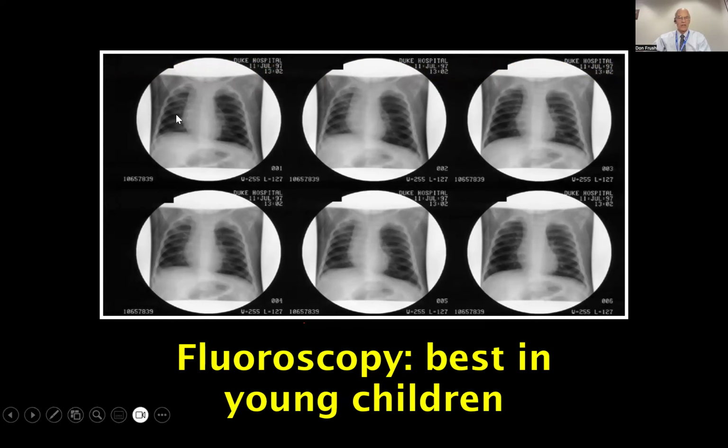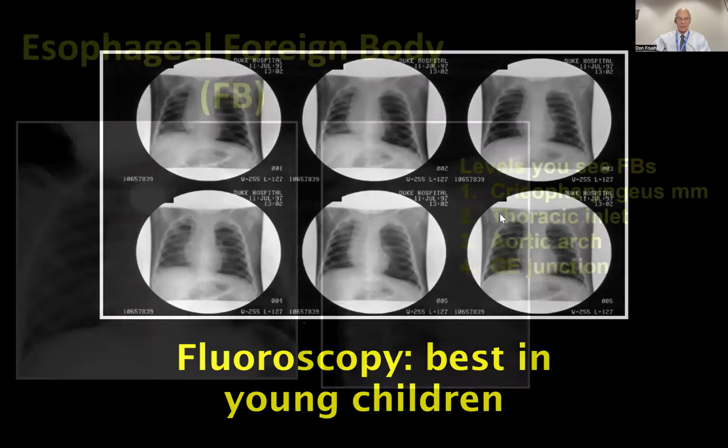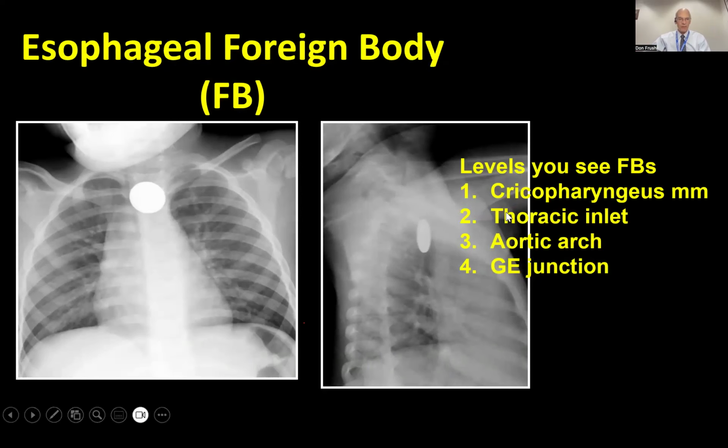And as you can see here, as a child just breathes spontaneously, changes in the lung volume here, gets bigger, the right lung gets bigger, it's bigger than this here. Now it's getting smaller again. Look at the left lung. It doesn't change. So the fluoro, because it's a dynamic examination, lets you determine whether there's air trapping a little bit easier than the decubitus films here.